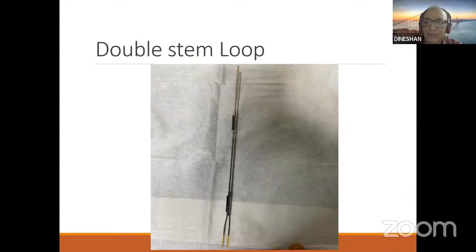And for all the pediatric resectoscopes, the hole will be on the left side, rather than here, where in the adult resectoscope high frequency loops, you have the hole at the right side, and in the pediatric you have the hole here. So that's the difference.